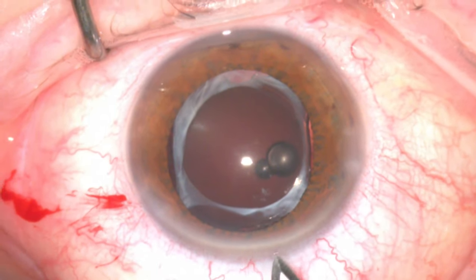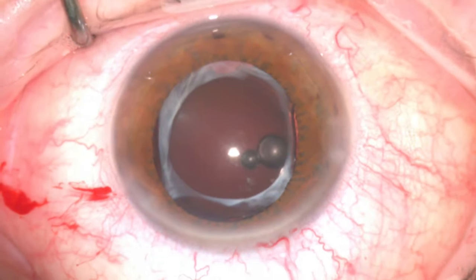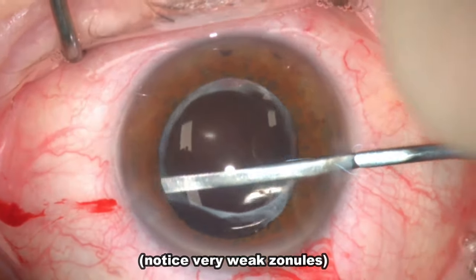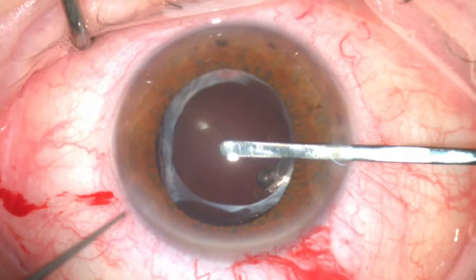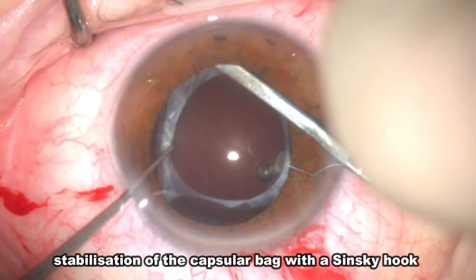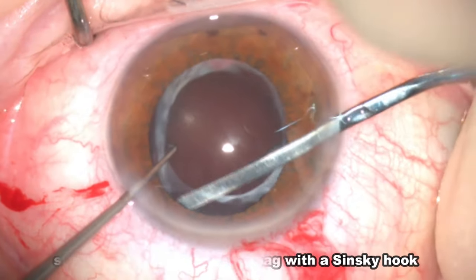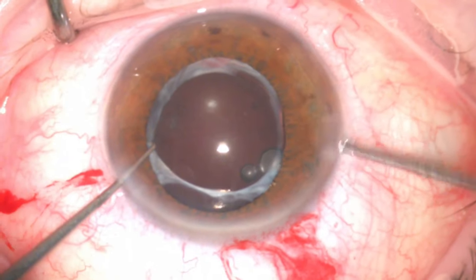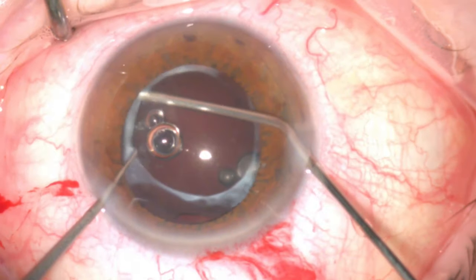Then the main incision was made using a 2.8mm keratome and further gentle sweeping with a spatula to make sure all adhesions were cleared. Notice the very weak zonules and unstable capsular bag complex. Therefore, a second instrument, such as a Sinsky hook, was used to stabilise the capsular bag. Further visco-dissection was performed to clear any residual adhesions.